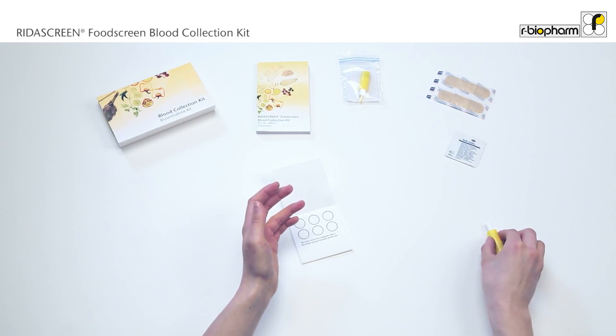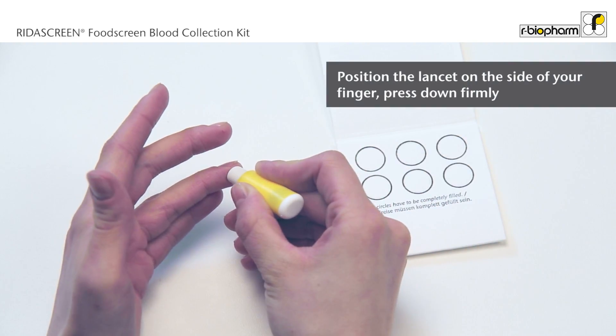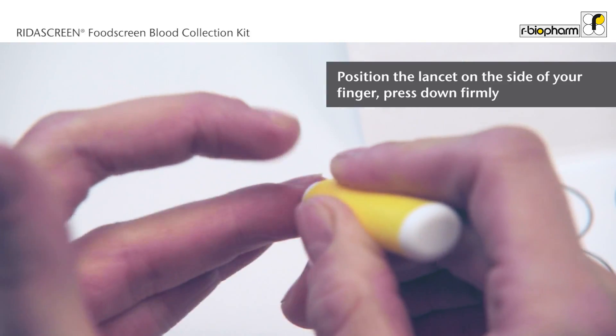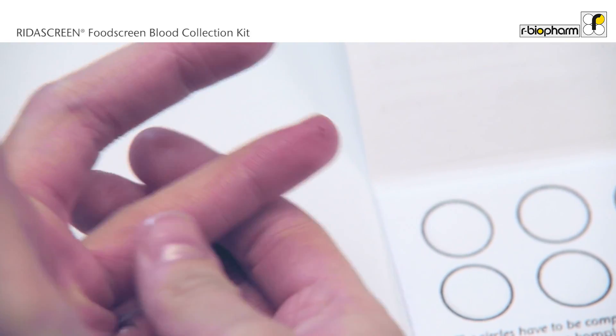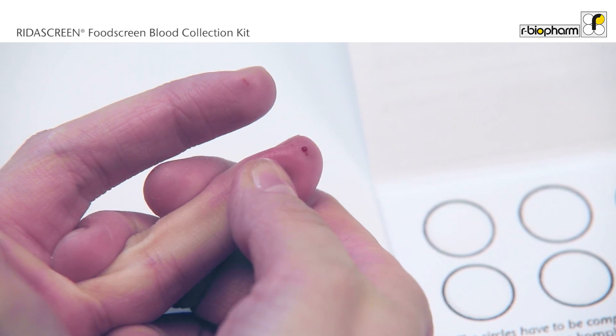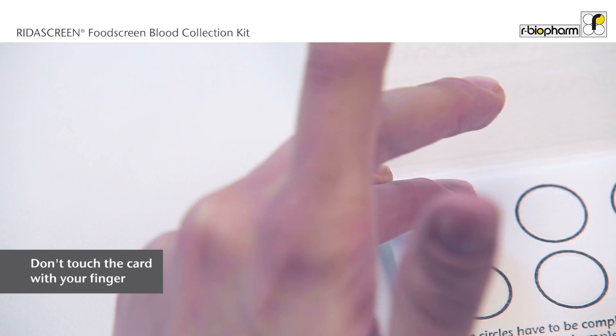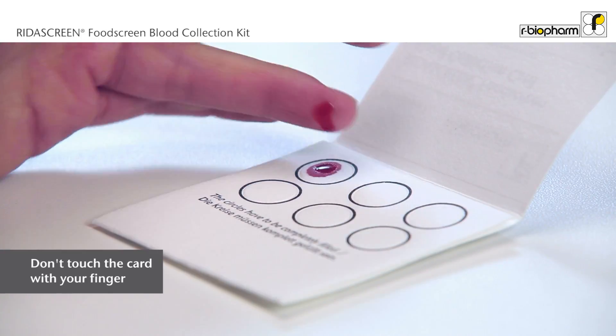Position the lancet on the side of your ring finger and press down firmly against the puncture site to activate the device. Massage the entire length of the finger to allow a large drop of blood to form. Let the blood drop touch the card and soak into it. Please do not touch the card with your finger.